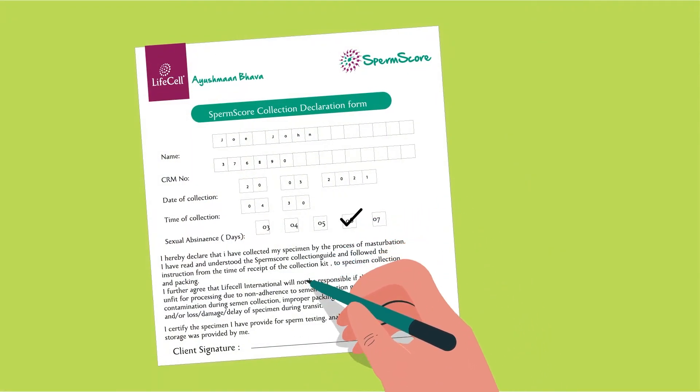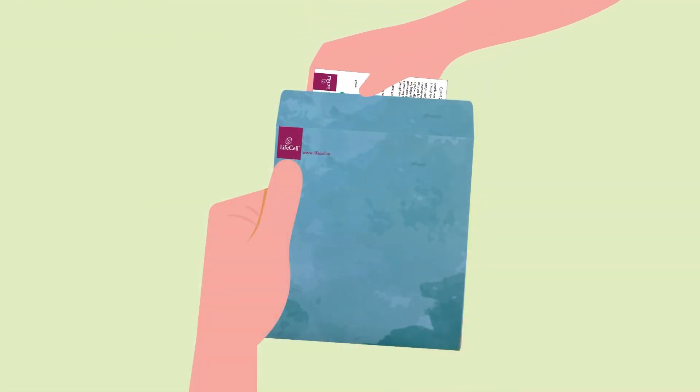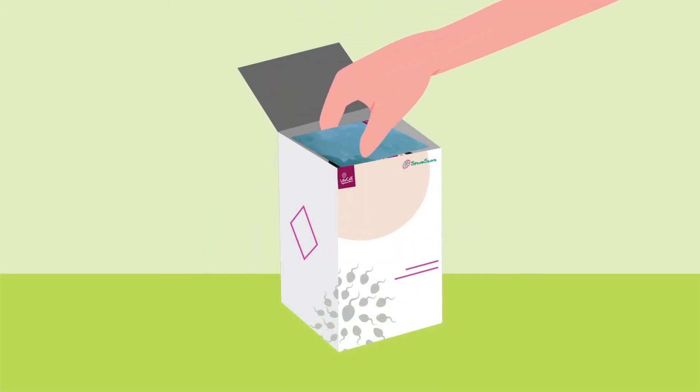Paperwork: Fill out the semen collection declaration form and place the form in the envelope provided with the kit. Don't forget to place the envelope back in the carton box during dispatch.